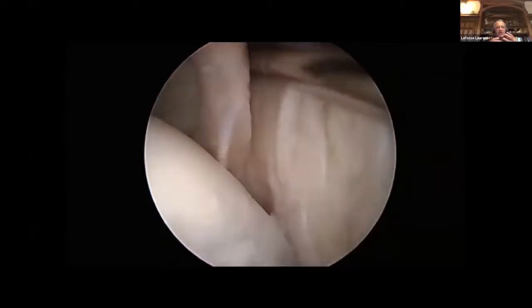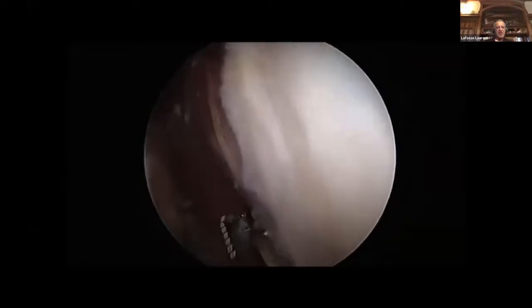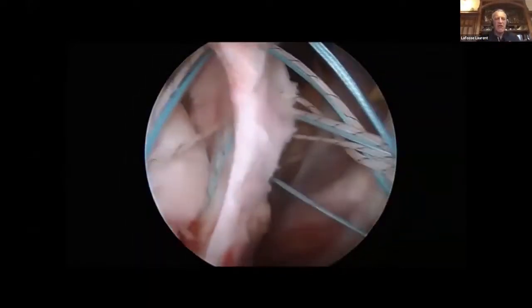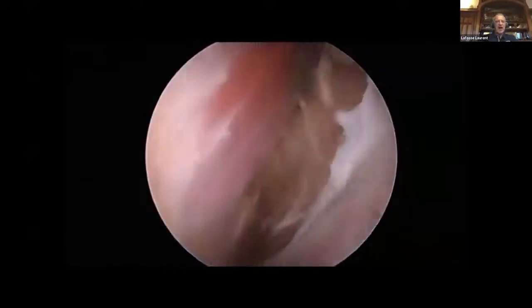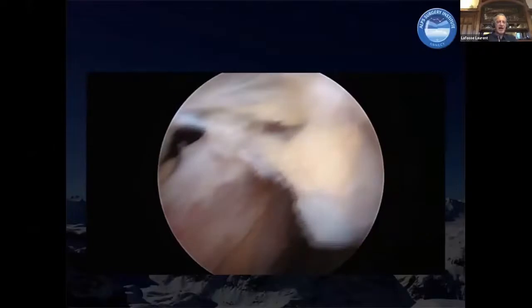It's very important in the shoulder now to know from which room you are treating which tendon, because a tendon is like a wall in the house of the shoulder. It's not a house with only one room. It's a house with several rooms. We are communicating, and you need to open windows between the rooms in order to restore the wall. This is where we can restore the wall. And you see we have access from the subcoracoid space, subacromial space, and intra-articular space.